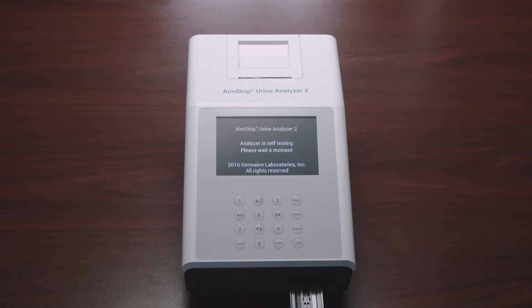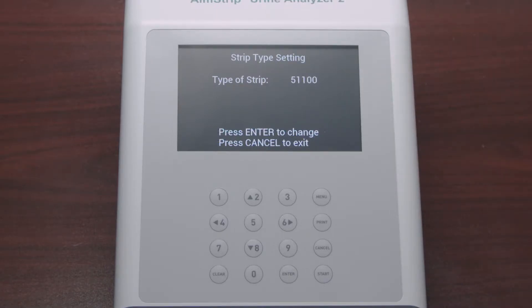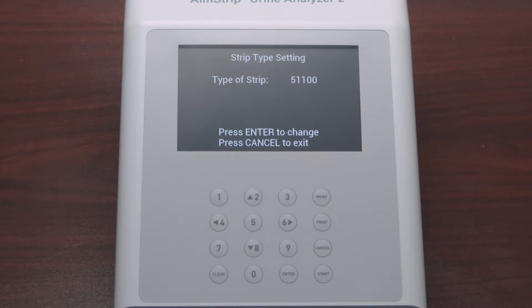After the self-test is completed successfully, the following screen will appear. Verify that the strip type shown on the screen corresponds to the type of strip you will be running. If it does, press Cancel to reach the main screen, also called the initial screen.